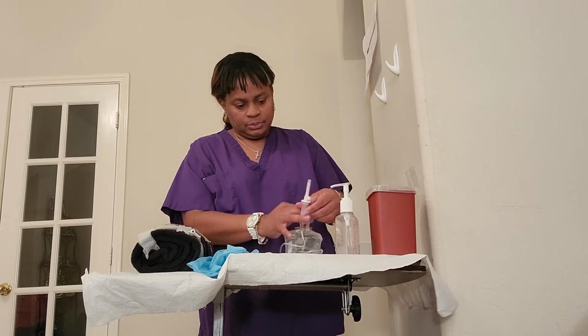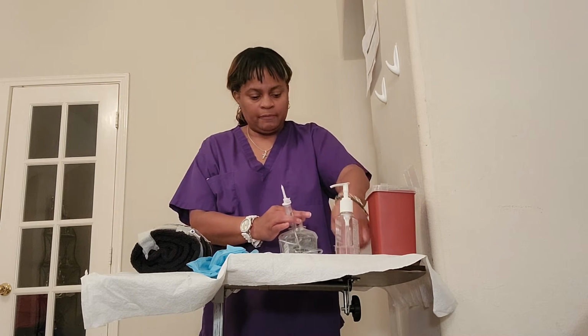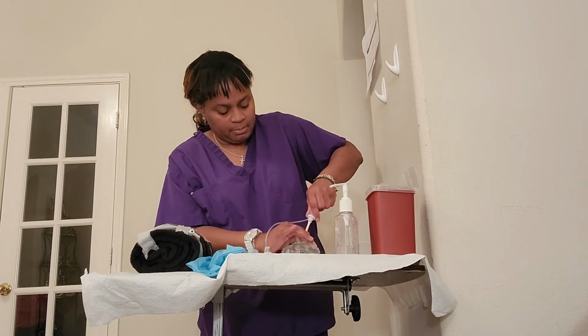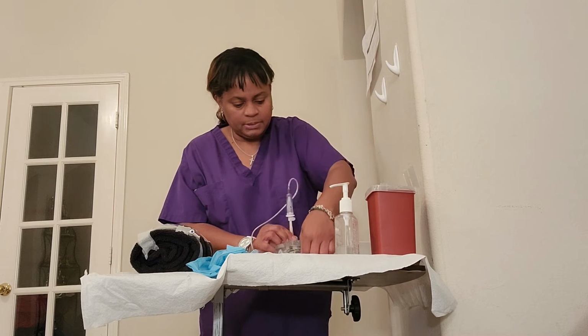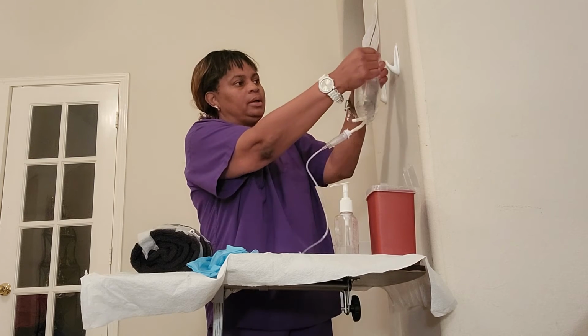I'm going to take the top off the spike part, and now I'm going to hold it inverted and I'm going to spike the bag. Okay, the bag has been spiked. Now I can turn it upside down, and I'm going to hang the bag.